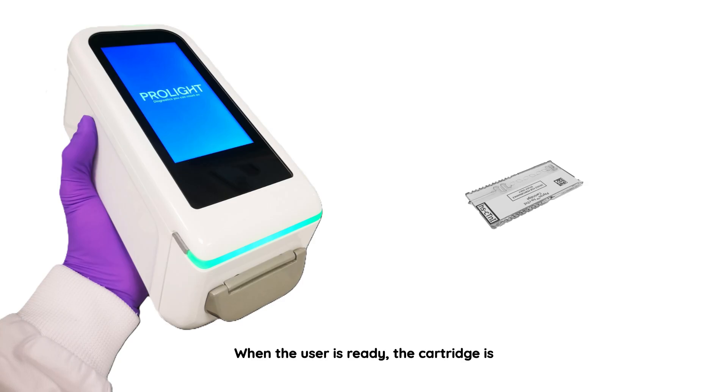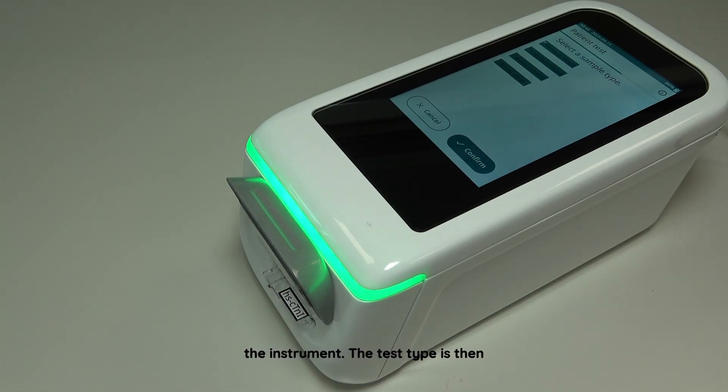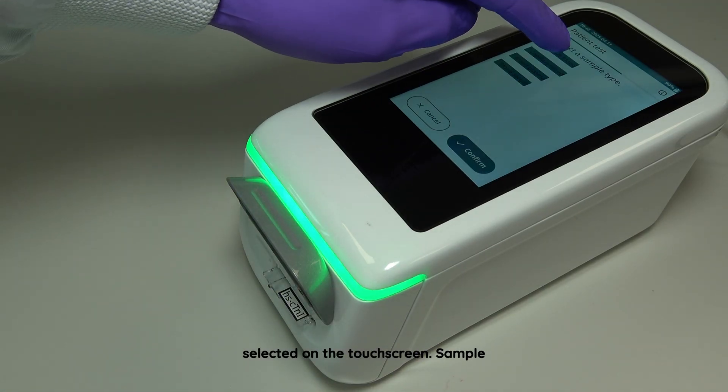When the user is ready, the cartridge is removed from the pouch and inserted into the instrument. The test type is then selected on the touch screen.